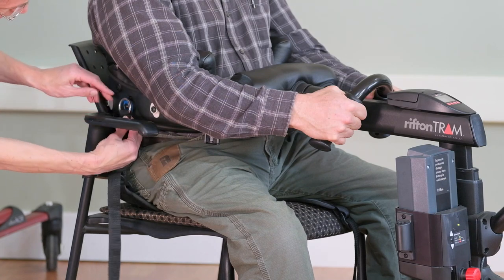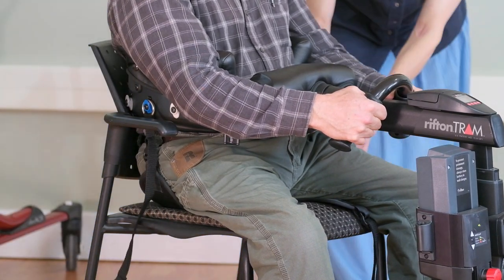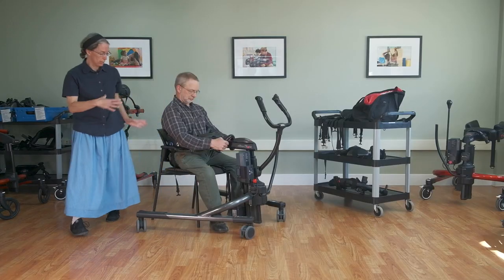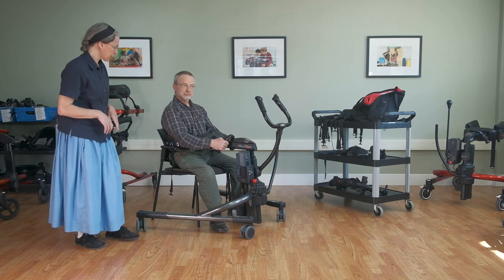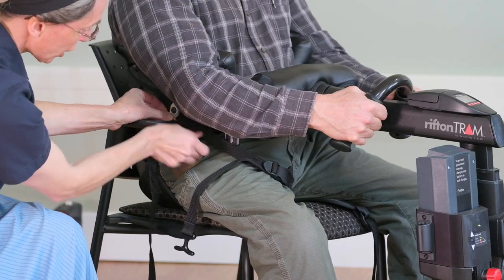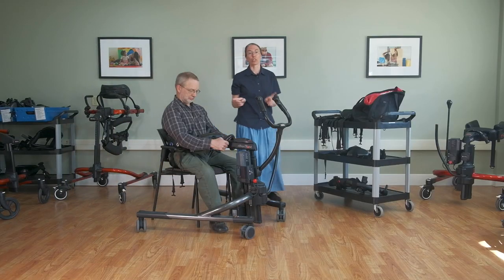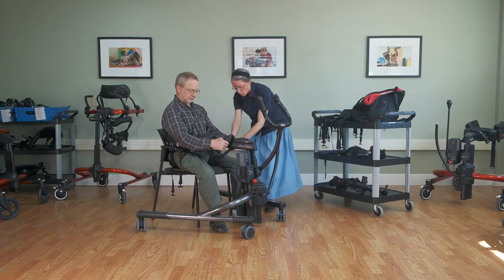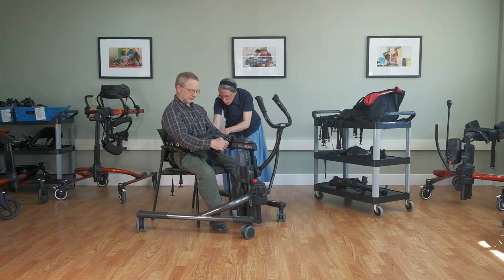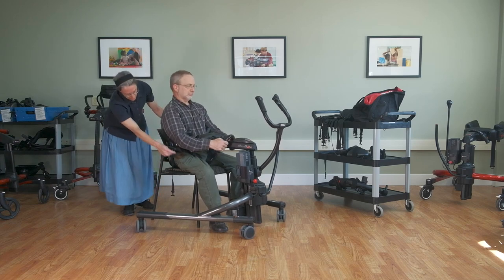Typically you're just going to bring that strap up to the closest clip and secure it, and that's going to be your weight-bearing assist. The very first time you get an individual supported in a standing and walking position is a bit of trial and error, because you have those four clips where you could attach the straps. Take a look at the positioning and if you need to reseat him to reconfigure, you can do that and then document after that first time what works. In this case I'm bringing the front straps around the inside of the thigh to the adjacent clip — front ones on the white and the back ones on the blue.